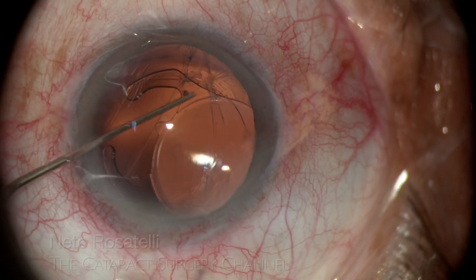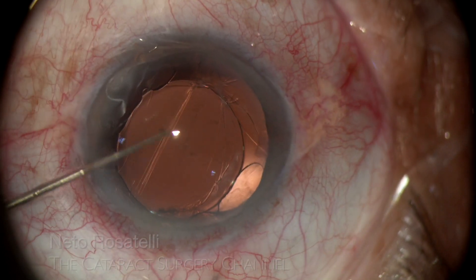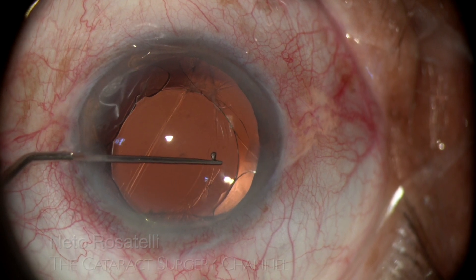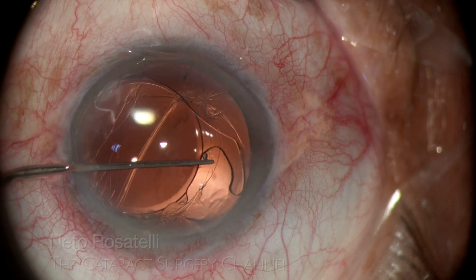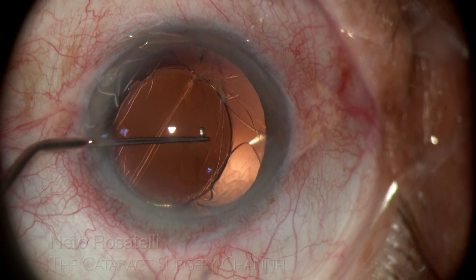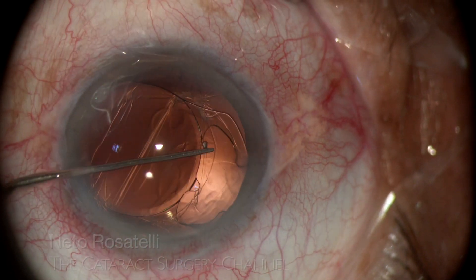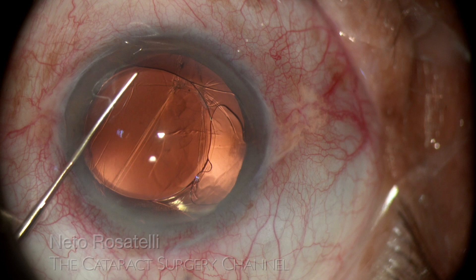With help of a lester hook, I then probe the IOL and begin to maneuver it to bring it back to the anterior chamber, and I am horrified to notice how precariously it was hanging in that position. It confirms my suspicion of anterior hyaloid integrity, as it remained in that position without falling to the vitreous cavity, because it was resting on the anterior hyaloid face.